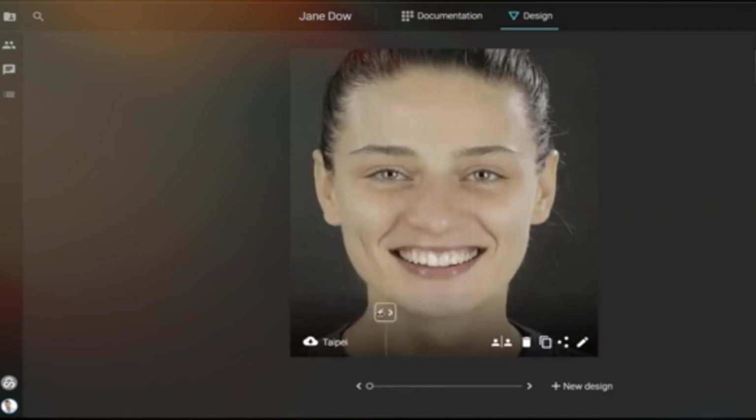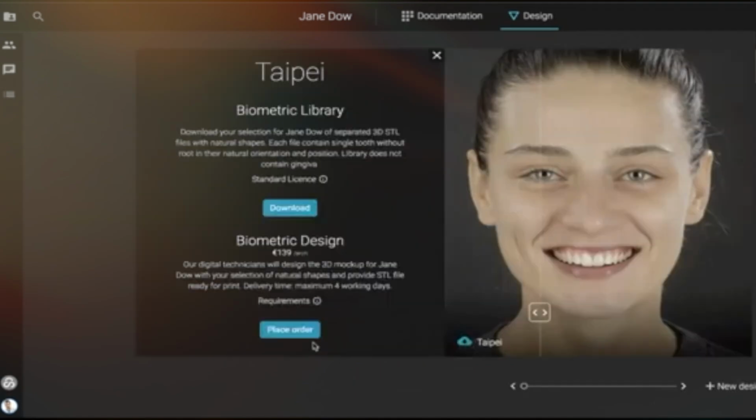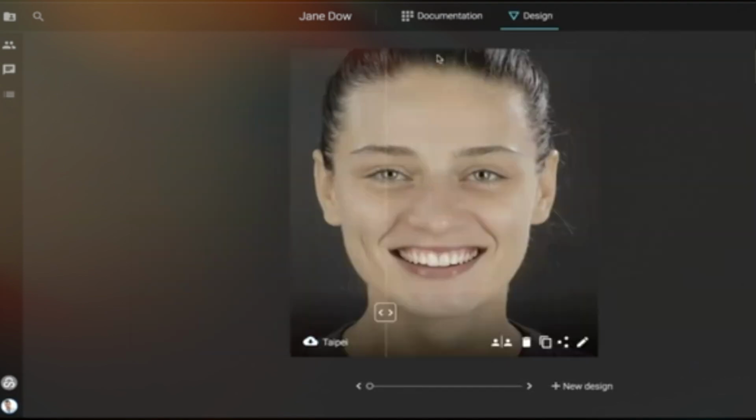Normally you have an entire process to get here, because you need to print, you need to do the whole design, print the model, etc. And it's a liability. You can waste time, resources, everything. The way we do it is we select the library, agree with the patient, and then we start the process, so we don't waste resources and time.